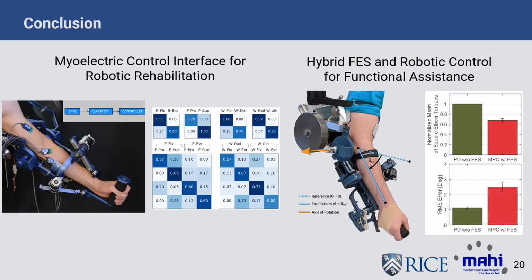That's actually a pretty good question. I've done a lot of manual tuning to make sure that it remains comfortable for users. The main preference for users is that it doesn't result in oscillatory motion. I mentioned that that's certainly a possibility with FES. If we basically lean entirely on FES for the control input, then it results in some oscillatory motion.